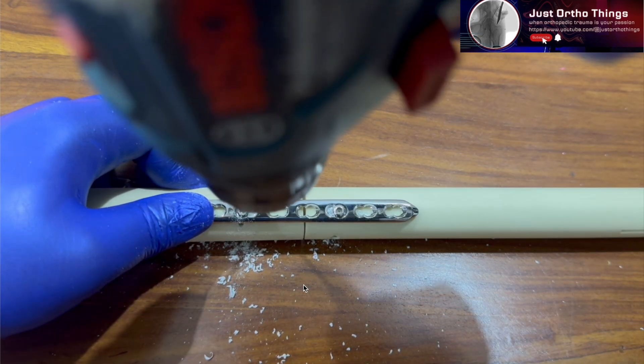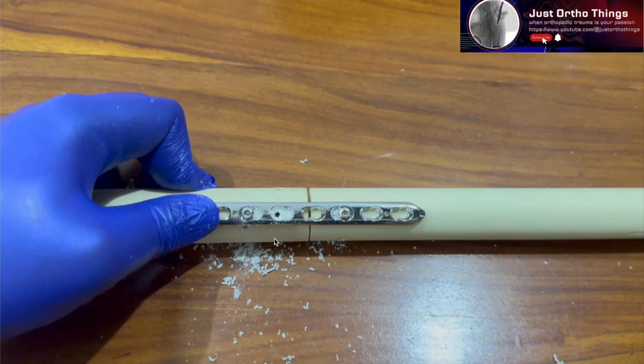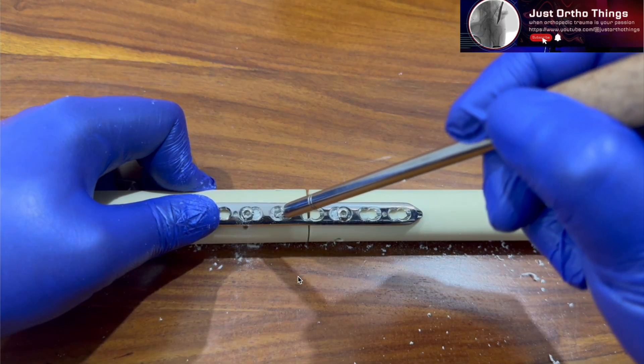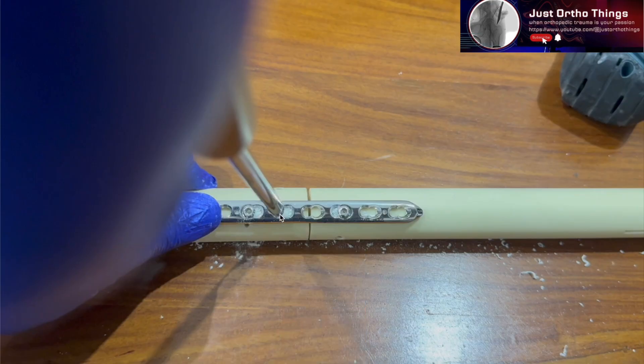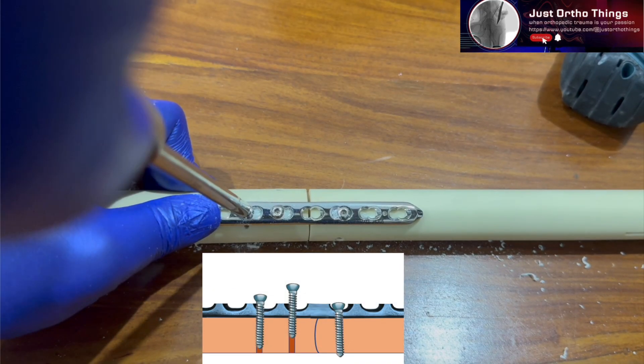To gain the remaining 1 millimeter, place the drill bit in the eccentric direction again — using the sleeve pointing towards the fracture side — so the drill hole is close to the metallic edge of the screw hole. You can see the second screw hole is again along the metallic edge, not in the central position. Now place the screw, but stop before the head gets fully engaged inside the slot. Once half the screw is placed, you must loosen the head so it is not inside the slot.